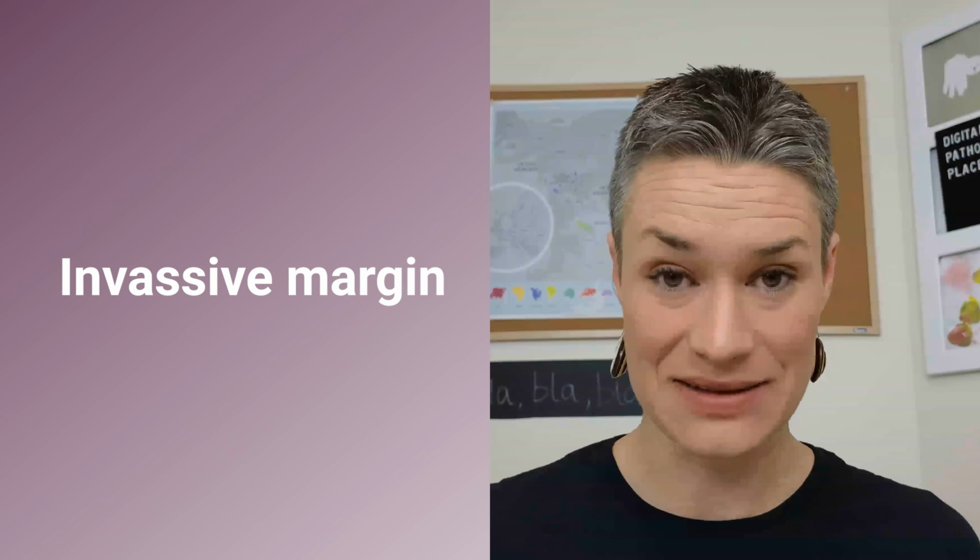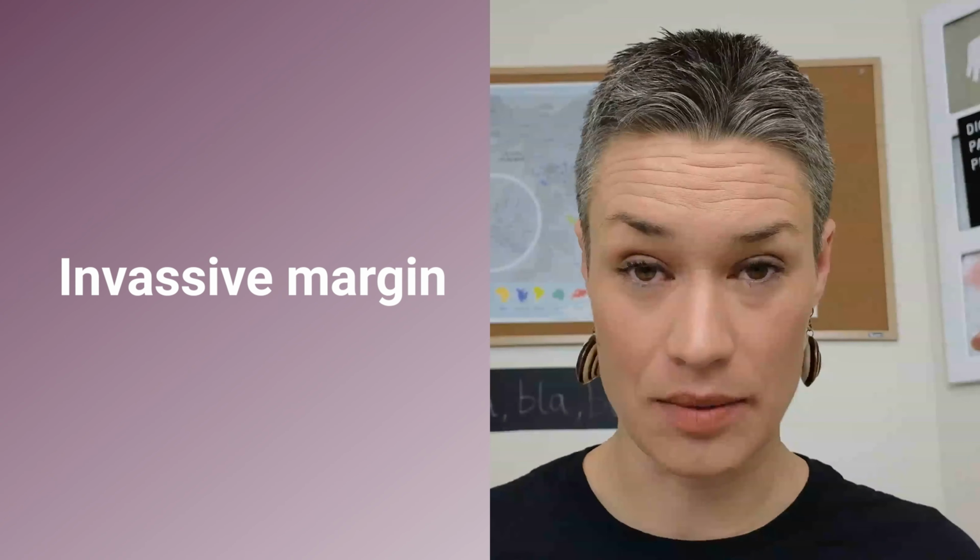We might want to know whether they're in the tumor stroma or in the tumor epithelium. In general, the concept is if they're going into epithelium, they're fighting the cancer epithelial cells, which is good. We want that. If they're in the stroma, that's already a good sign because they went into the tumor. Also good. But epithelium, even better. But sometimes they aggregate on the periphery of tumor, also known as invasive margin, when the tumor is invading non-neoplastic tissue. This is good. They're making their way to the right place, but we would want to see them in the tumor epithelium.